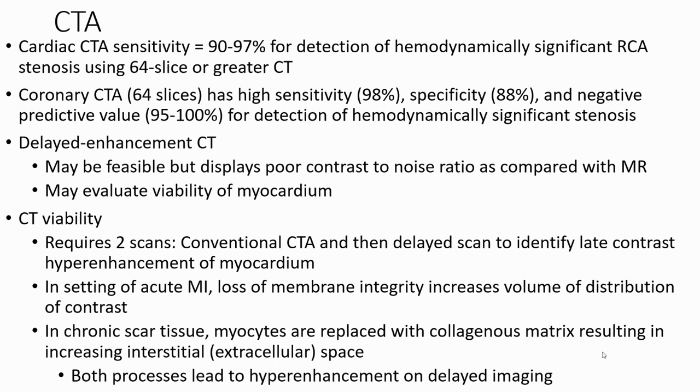Cardiac CTA sensitivity is around 90% for detection of hemodynamically significant right coronary artery stenosis using 64-slice or greater CT.